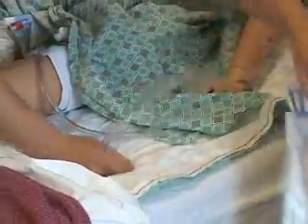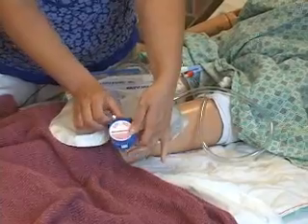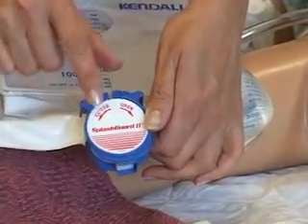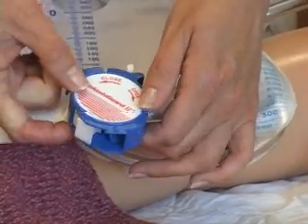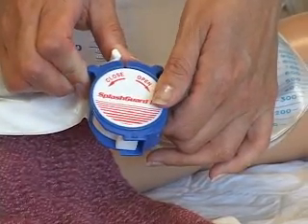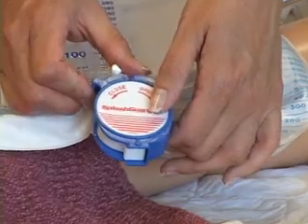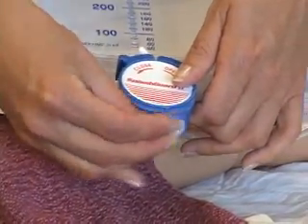For the nighttime drainage bag, the valve is a little bit different. There's a lever here that you would open. There's arrows here that show you how to open the lever, and the bag simply drains into the container into the toilet. When you close the bag, it's important to hear the click so that you are assured that the bag is closed. And again, use an alcohol prep pad to cleanse the bottom of the valve.